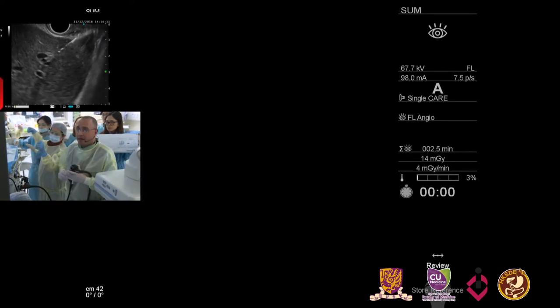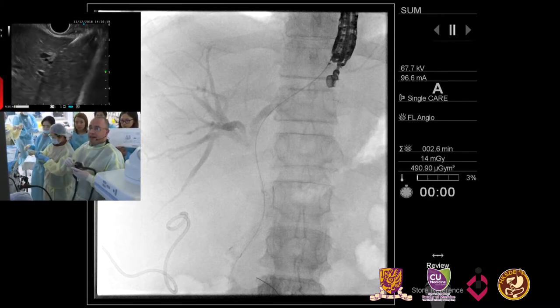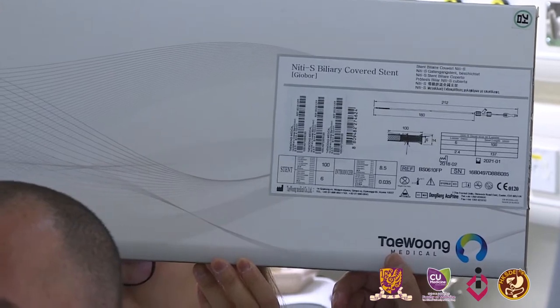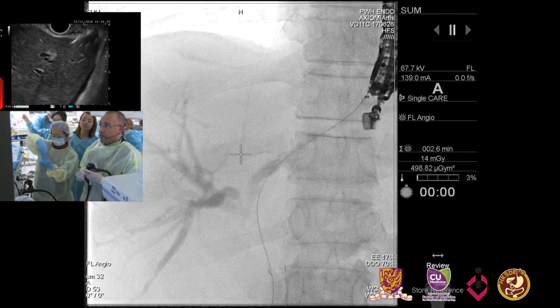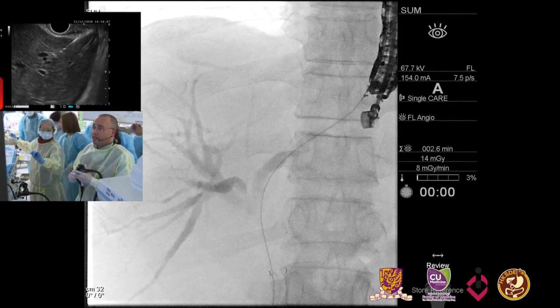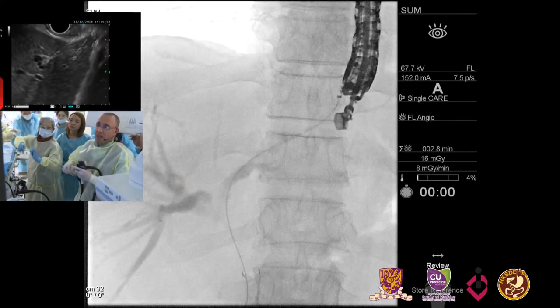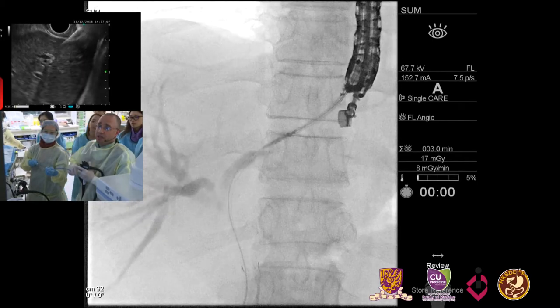So this is, again, a 10 centimeter stent that has an uncovered part that's going to be on the inside, towards the hilum, so it avoids obstruction of any biliary radicals. The covered part will be between the stomach and the liver and on the stomach side to avoid any leakage. And it's 6 millimeter in diameter. That should fit. So I'm on EUS, I'm keeping the wire view, and we're going to go with fluoroscopy here. Let's just keep the tension going on fluoroscopy. Yep, that's good. Okay, so now we're going to open, and just give me some tension here, and the stent will go nicely, excellent.